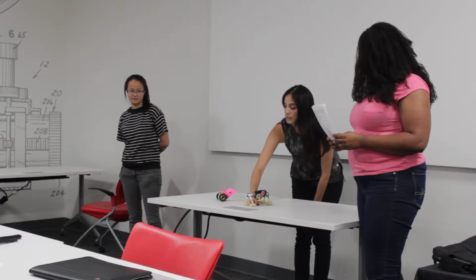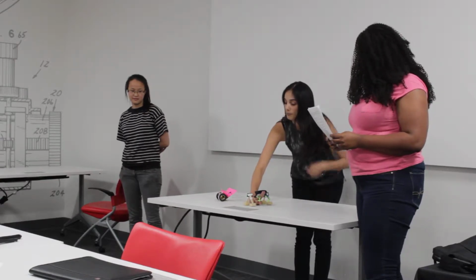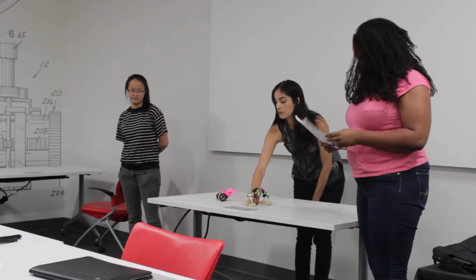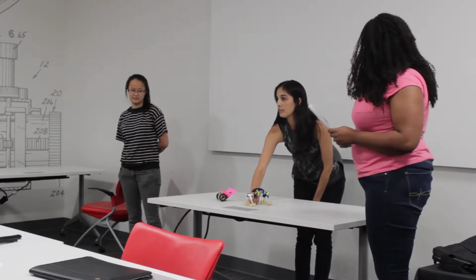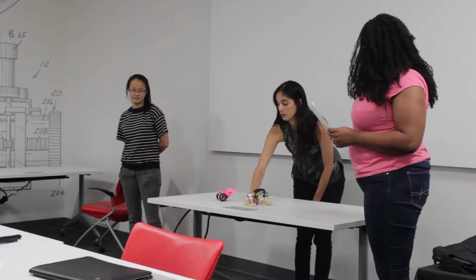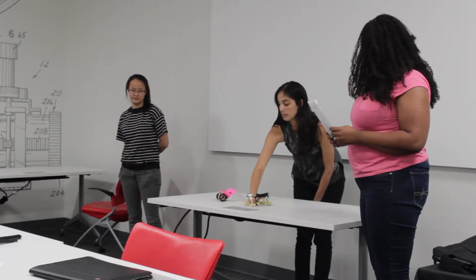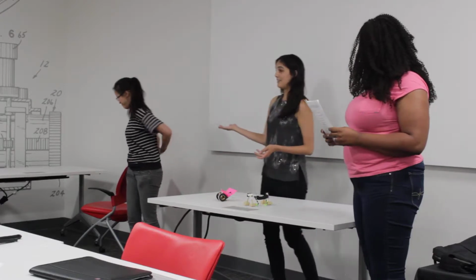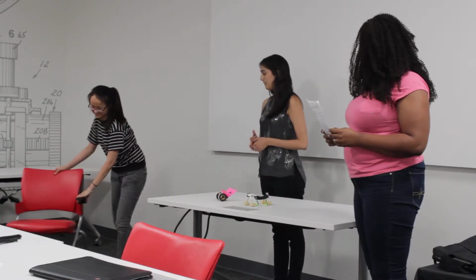And whenever he's comfortable, he can put his head through the hole. And when he sits all the way up, his arms are above his head and he can wiggle the t-shirt over his shoulders. When he's done, he simply bends over again and rolls back. So let's show it with Amanda, so it's a bigger example of it.